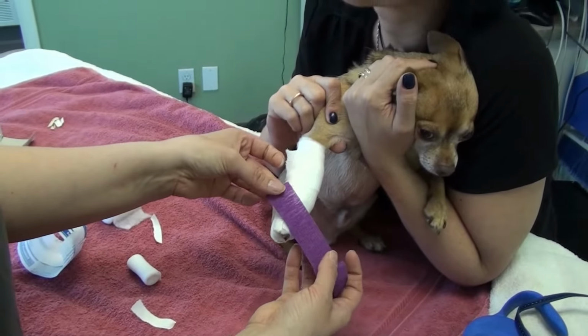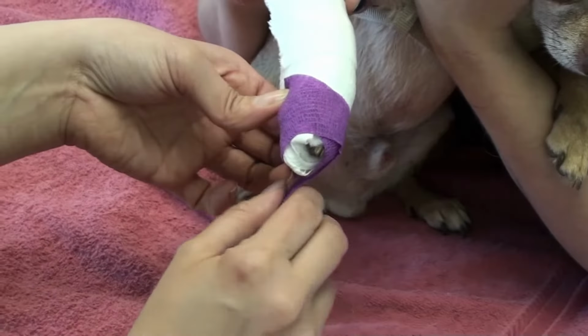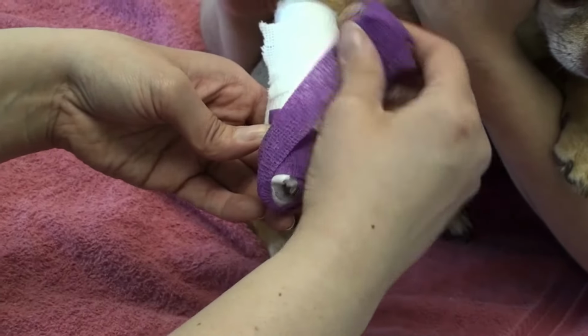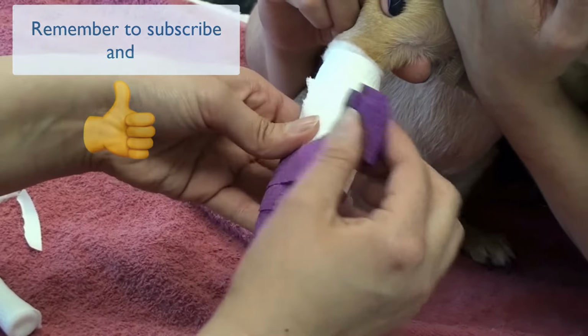The Vetwrap is then applied as the final layer, the protective layer, to the bandage itself, and just starting at the toes and working her way up, ensuring that she cradles the tip of the splint as well, just to further help hold it in place.